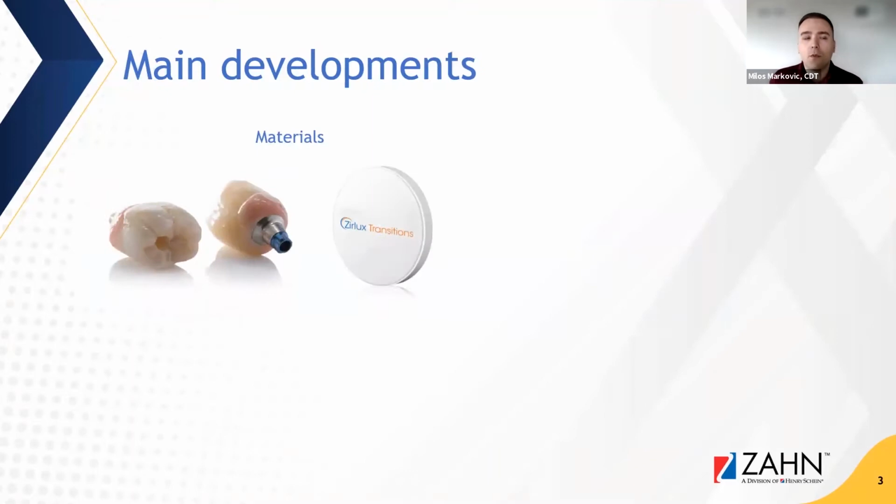So, main developments. We've had some new materials in the zirconia space, what I like to call the third generation of zirconia that keeps coming out in the last couple of years. When we initially started, we had zirconia that was really opaque. Then the next generation was the multi-layer gradient zirconia. And now we have this third generation zirconia that has all the strength, the 1200 megapascal strength, and nearly 50% translucency. Those have been the interesting things that have been coming out.